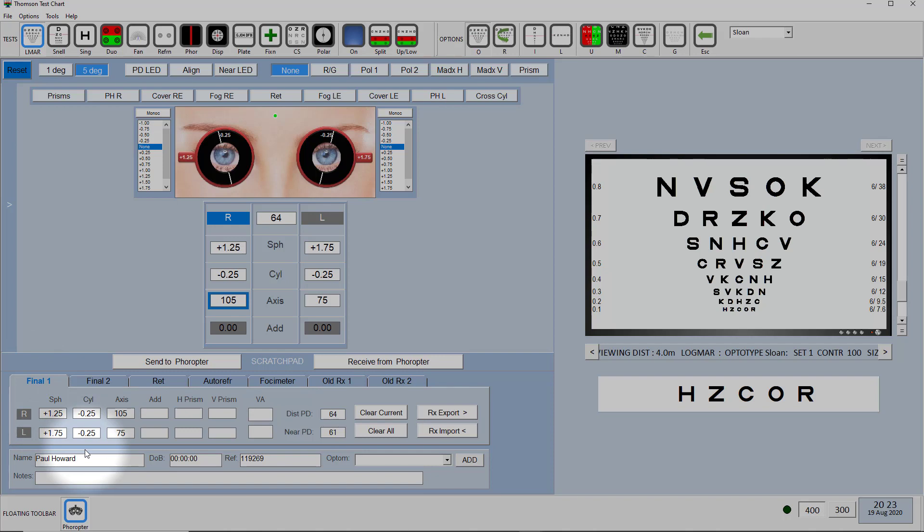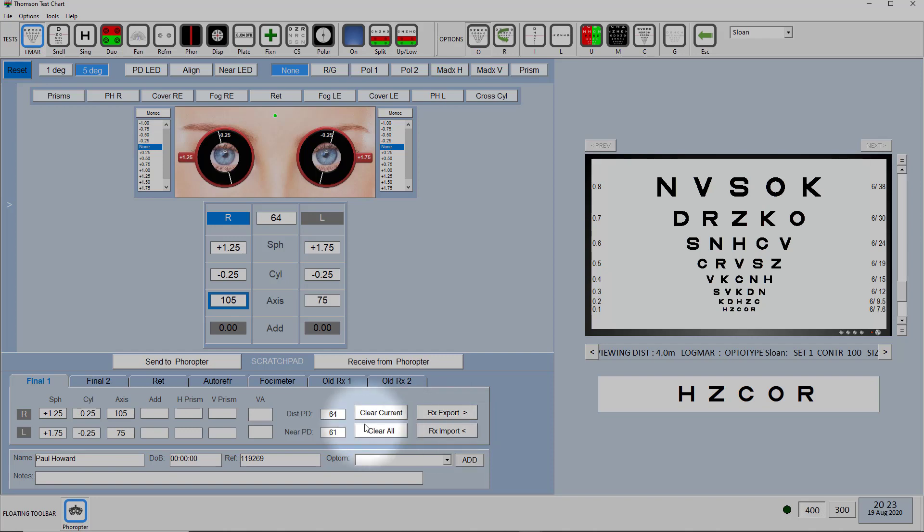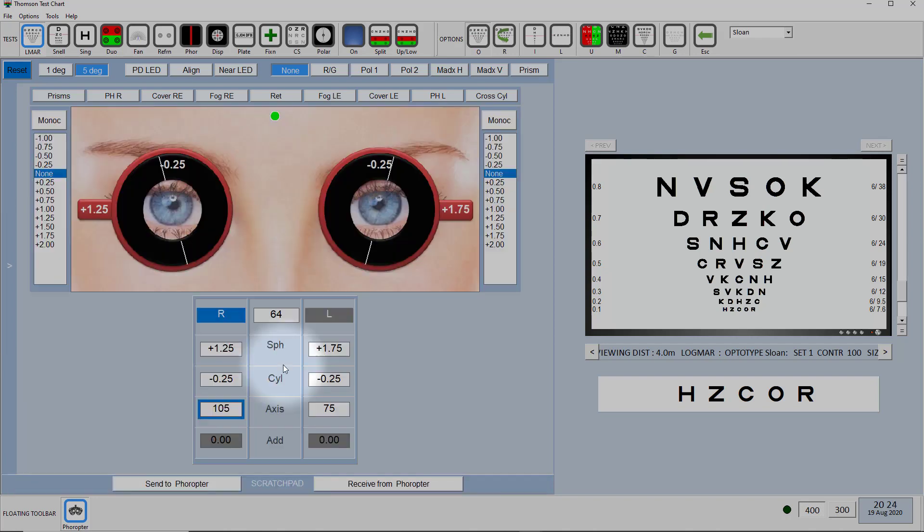So this makes for a really efficient workflow. You don't need to write anything down. You can simply take the patient's prescription from your patient management system, put it into the Phoropter, do your subjective, put it back into the final prescription, export it and then put it back into the patient record. So that is the scratch pad component of the Phoropter module.